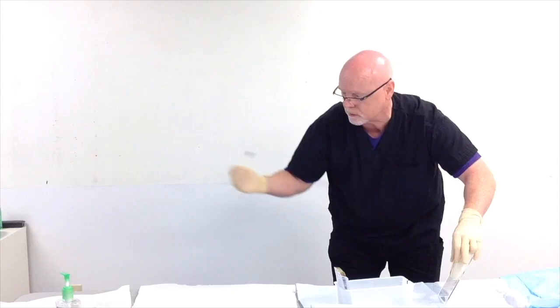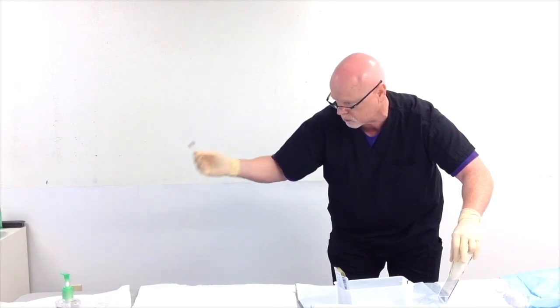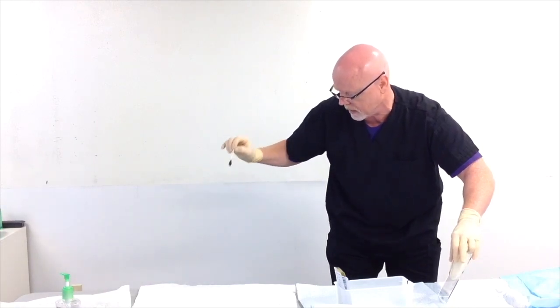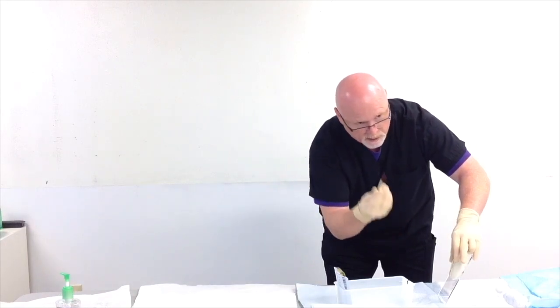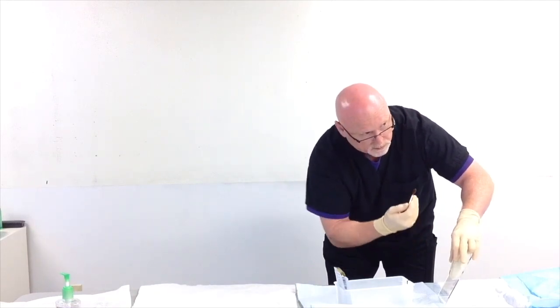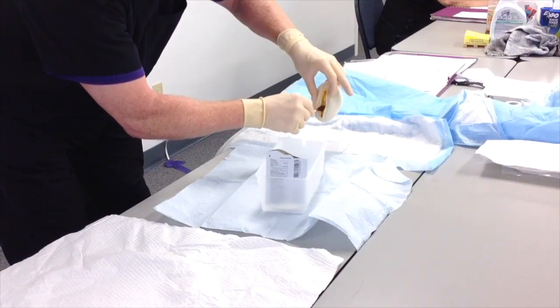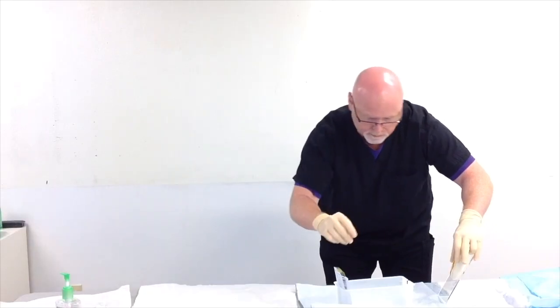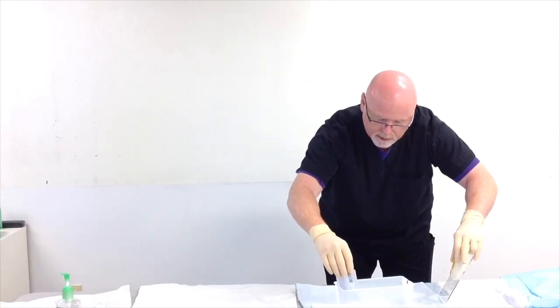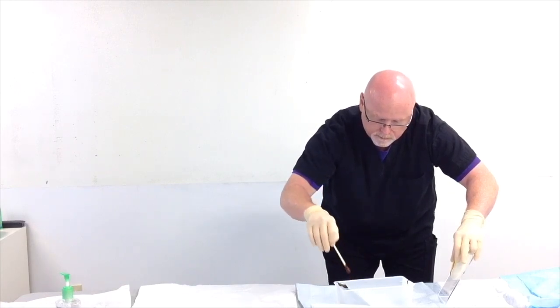Students have taken this and dropped it on top of their sterile gloves package also. But the trash can is a good place. It's good to pull the trash can right over here to you so that it's close to you. The next one is going to be the labia minora close to you. Straight down, trash. And lastly, the last one is going to go straight down the middle.